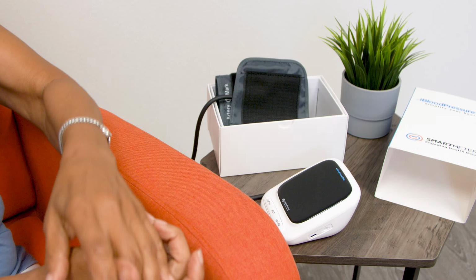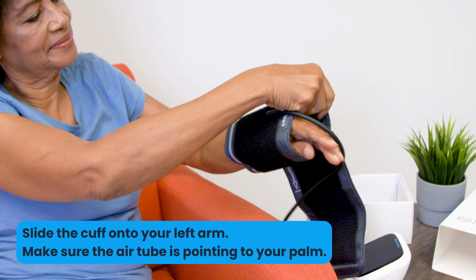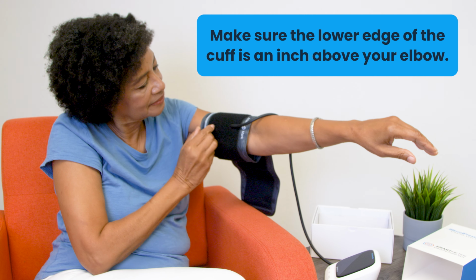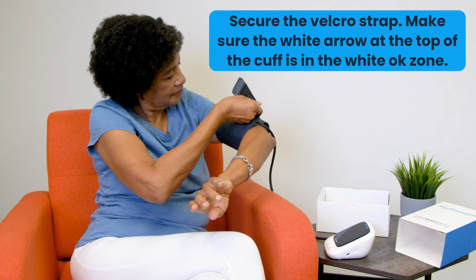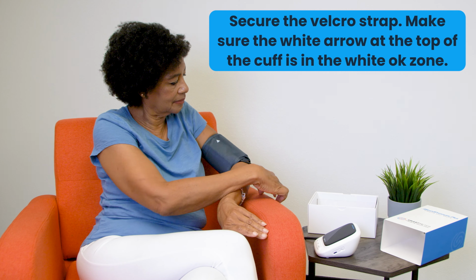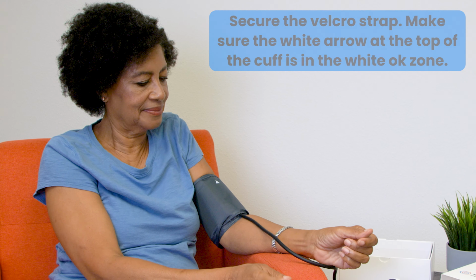To take a measurement, slide the cuff onto your left arm with the air tube pointing towards your palm. Bring the lower edge of the cuff an inch above your elbow and align the artery symbol on the cuff with your artery. Then secure the cuff by tightening the Velcro band and making sure the white arrow at the top of the cuff stays within the range of the white line on the inside of the Velcro band.